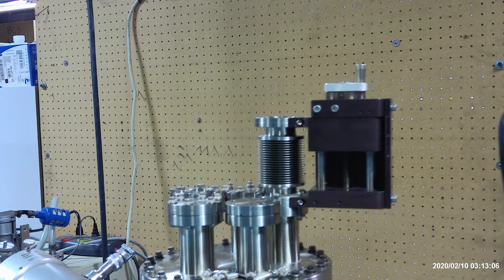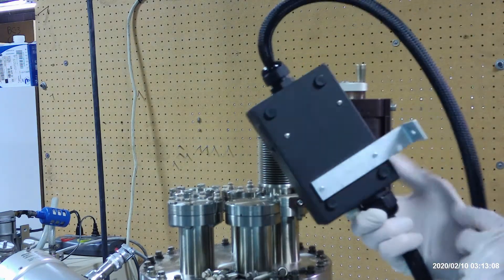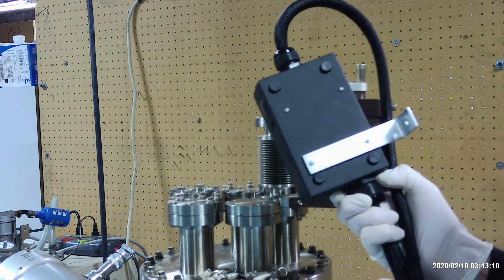Then we're going to install the preamp. The preamp comes with a bracket. Mount the bracket on the back of the preamp.